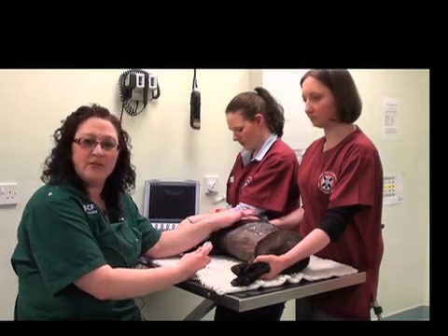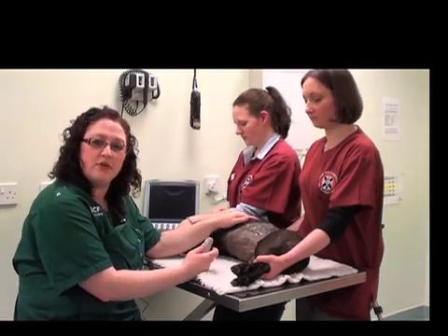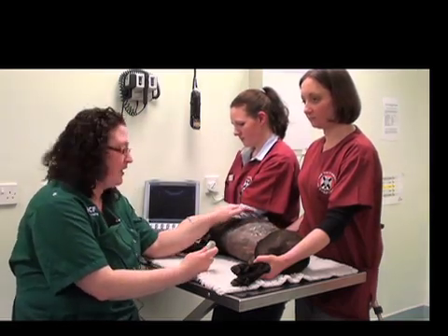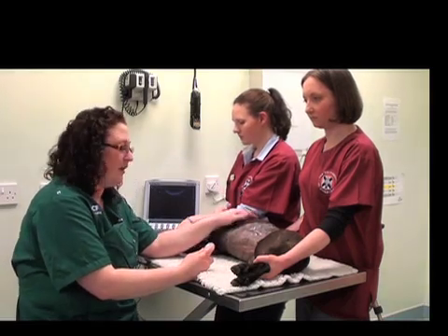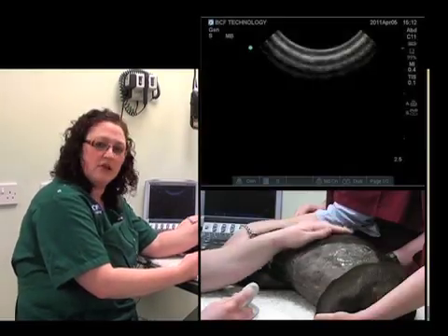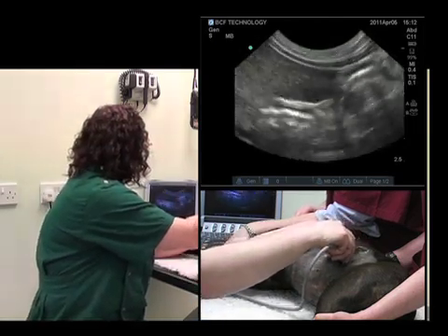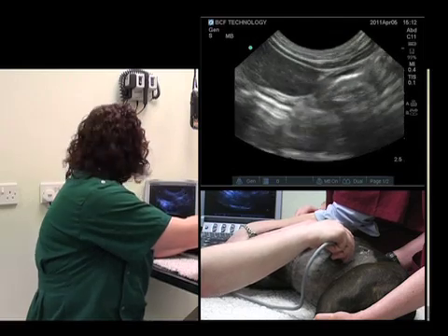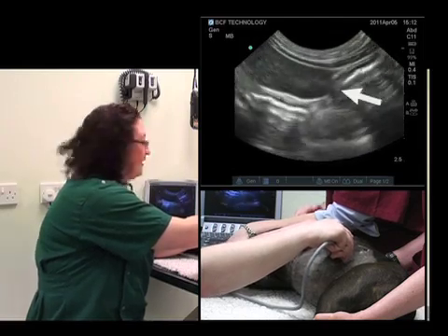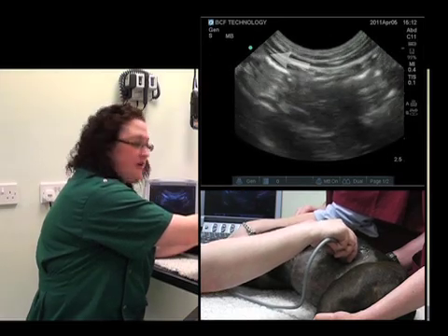It's important to remember when imaging the spleen that one of the motions you can perform with your ultrasound probe is pressure. The spleen is not a fixed organ — the tail is actually quite mobile, and the body as well. So when you're looking at the tail in particular, it's important to remember that motion of pressure. As you can see here, I'm not moving the probe, but simply applying pressure.